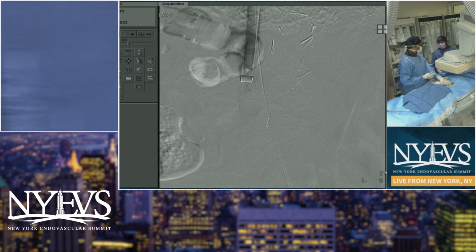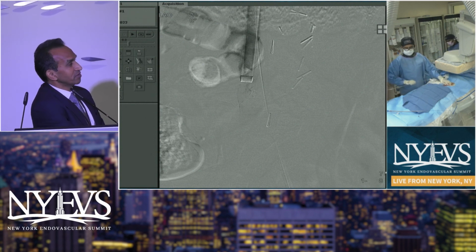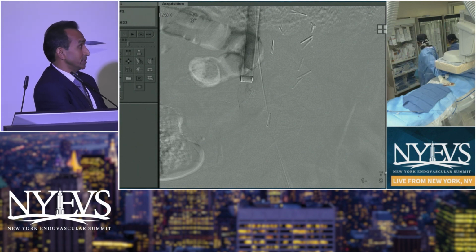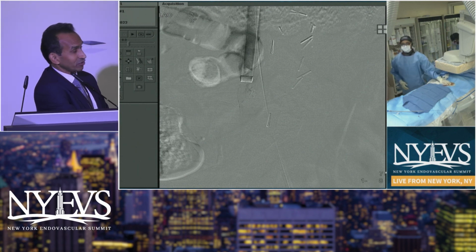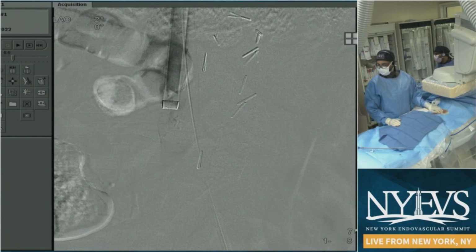But I mean afterwards, after they go home. You anticoagulate them during the procedure, of course, but let's say you had to do a lot of manipulation. Are you going to anticoagulate them to prevent thrombus on the freshly extracted site? I personally think only in the event of a really ragged looking IVC afterwards would I do that. That's a great point, though. Yeah, I think you have to see some evidence of thrombosis happening or early thrombus on the wall that's going to make you worried that it's going to extend and occlude that IVC. I'm more worried about a small tear and causing bleeding with that anticoagulation than I am about thrombus forming in that large vessel.